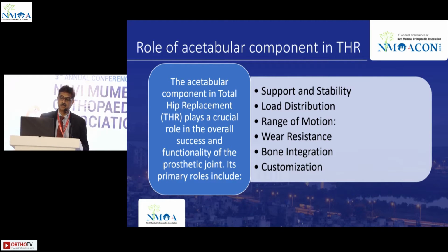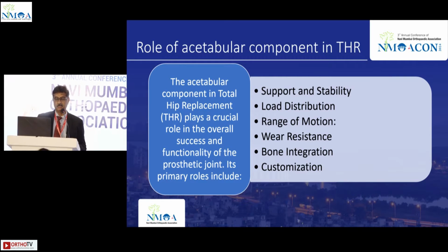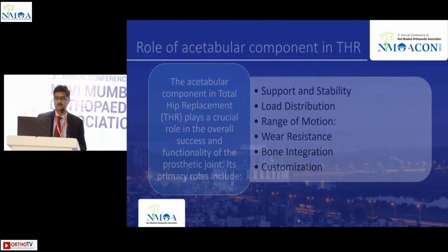The acetabular component in total hip replacement plays a very crucial role in the overall success and functionality of the prosthetic joint. So the main roles include support and stability, load distribution, range of motion, wear resistance, good bone integration, and we can customize it.